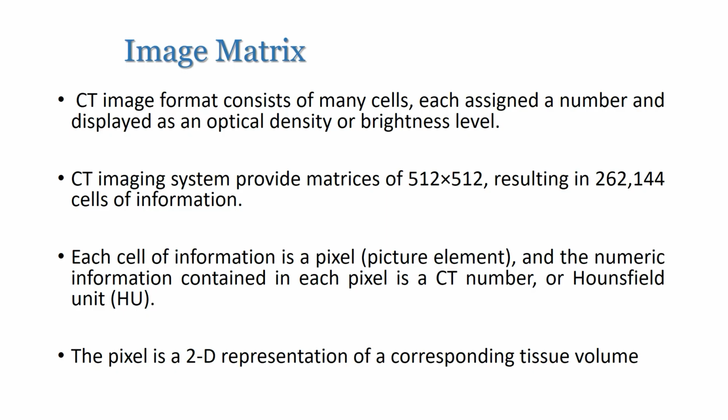The CT imaging system provides a matrix of 512 by 512, resulting in 262,144 cells of information.